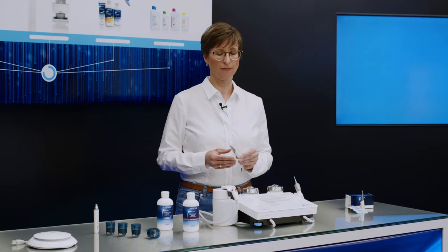The supra nozzle is suitable for removing supragingival bacterial coatings and discoloration during professional teeth cleaning or on patients undergoing orthodontic treatment, for example. The focused powder water jet even gets to hard-to-reach areas.